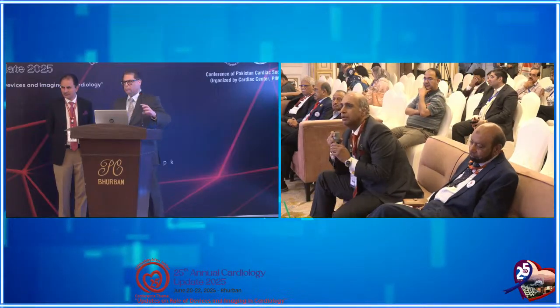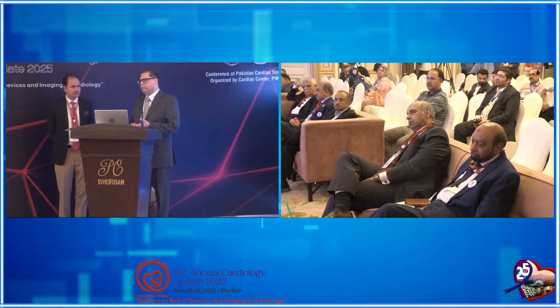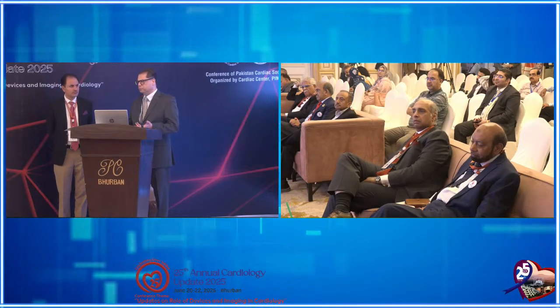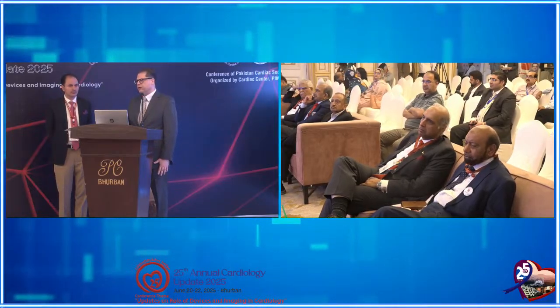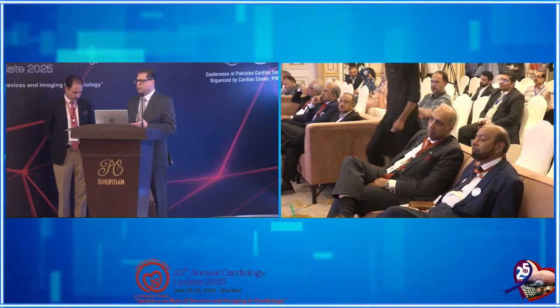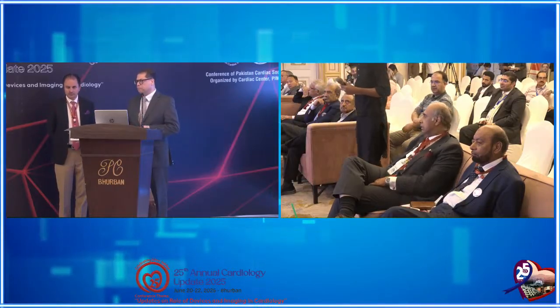So can we do something, in your opinion? Sir, I think in practice what we are doing, nobody is doing IVUS that frequently in routine angioplasty. So in practice, whatever appears angiographically normal, we are placing the stent there, and most of the times the results are quite good. Even in the developed countries, the penetration of IVUS is not 100%. So it might be 20-30% in routine PCIs, but in complex PCIs, if you are doing a left main or a multi-vessel, then I think IVUS will be very useful, especially in left main.